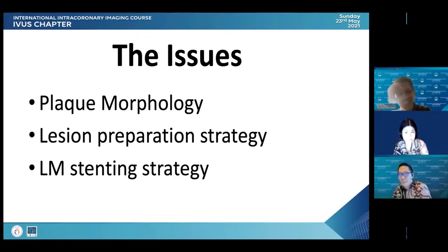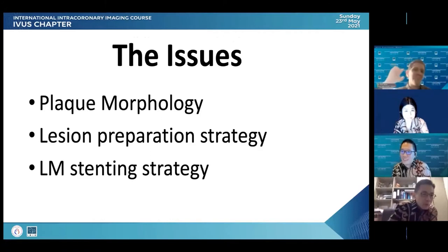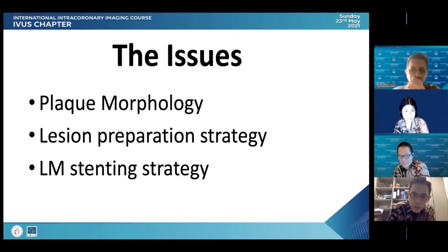Yes, I think we should still try to persuade the patient to go for CABG if possible, but if we are to do PCI, then I'll make sure the patient has good hemodynamic support. I don't know what type of mechanical circulatory support you have, but regardless of what you call it, I'll make sure it is put in place before you proceed further. It's definitely Medina 111. We have to intervene on the ostium of the circumflex, given that it's calcified and badly diseased. I think we need some form of atherectomy.